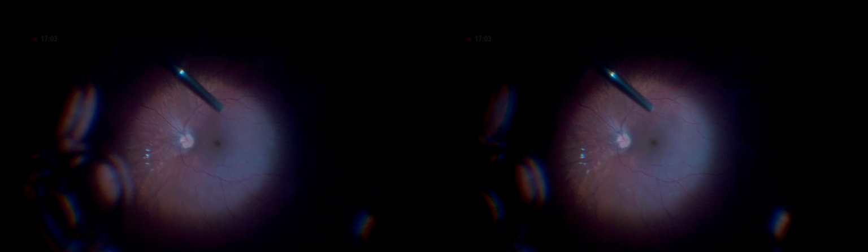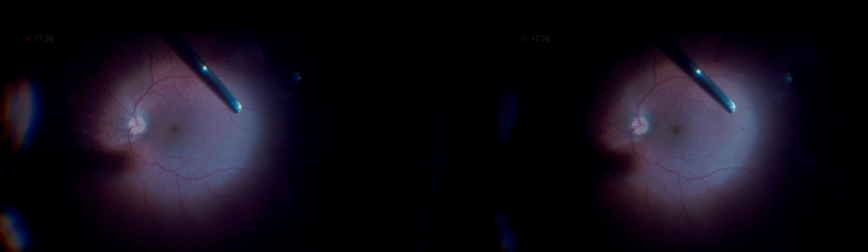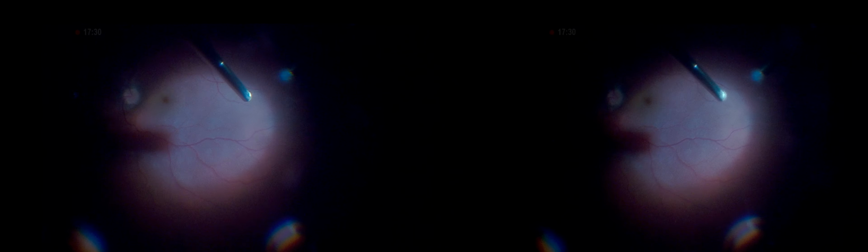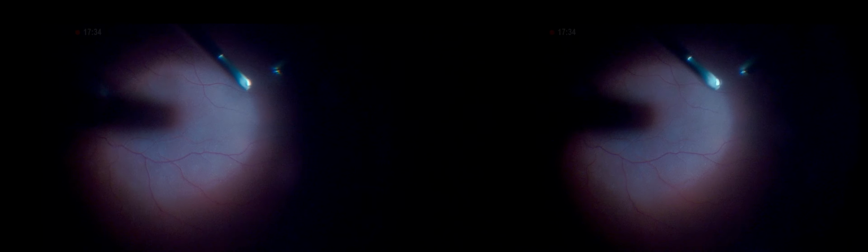There was a macula-off retinal detachment occupying all the temporal side of the retina with peripheral shortening. Vitreous was removed with core and peripheral vitrectomy, the eye being tilted temporally so as to reach most of the periphery without touching the lens. All hyaloid remnants ought to be removed because no traction is desirable on the retinal surface.